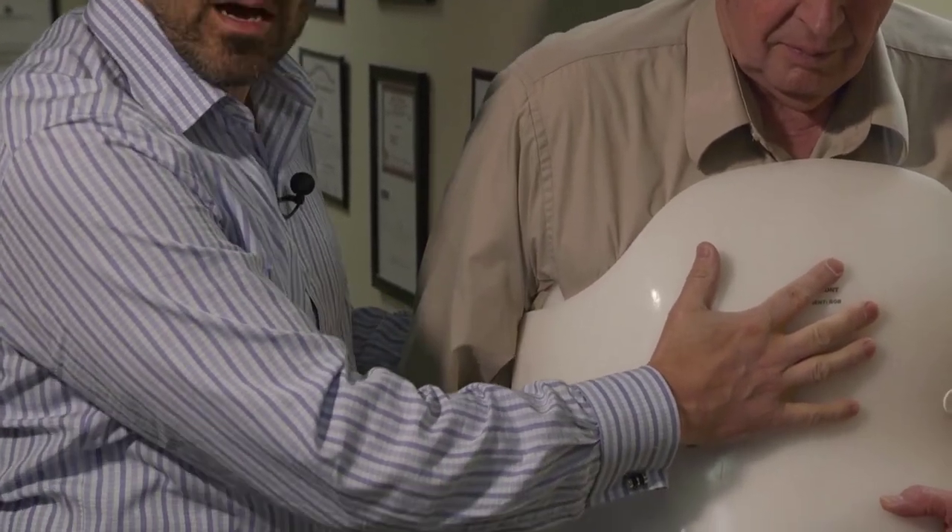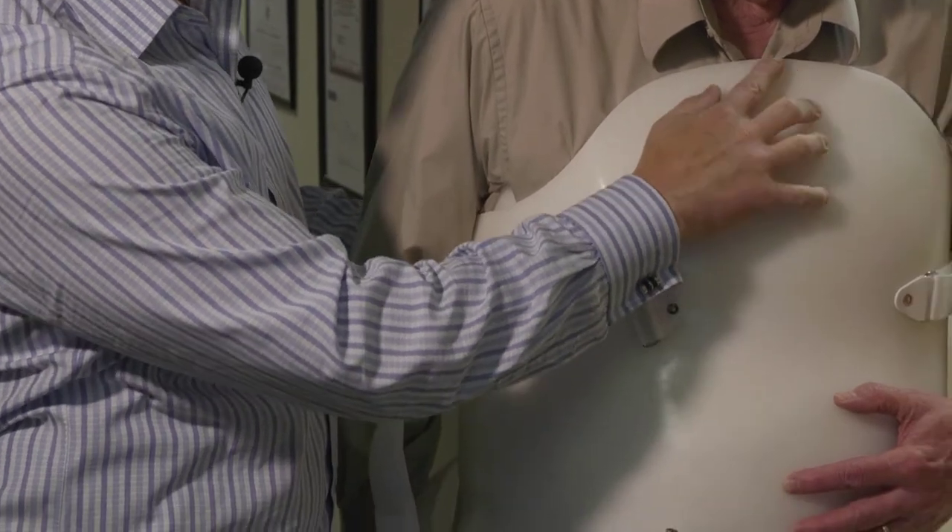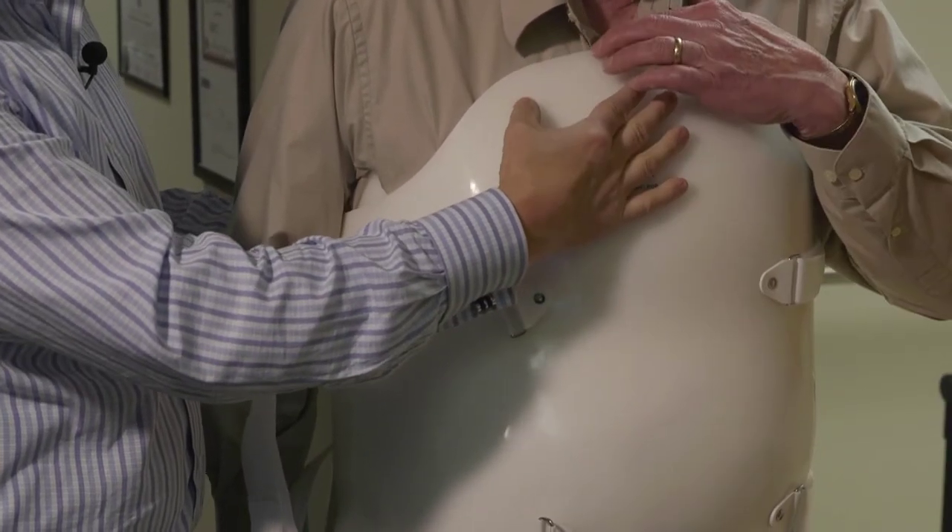Right now this is where the height is on Bob. Once it's cinched up, this is where the height will be. Bob, is that in your sternal notch at all? Is it in your neck?